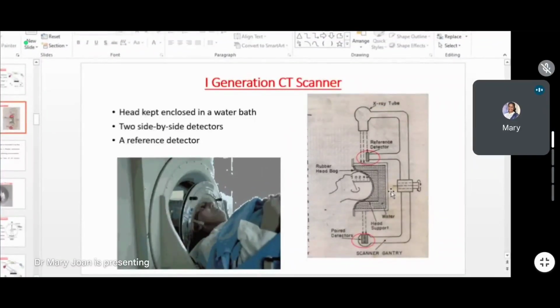It will just attenuate only. So filters are those which will attenuate and completely absorb the X-rays. Some of the low energy X-rays will be completely absorbed and whatever low energy remains will be attenuated. Here, the density of water is such that with respect to the energy of the X-ray beam coming, it will only attenuate it. It will not filter it.